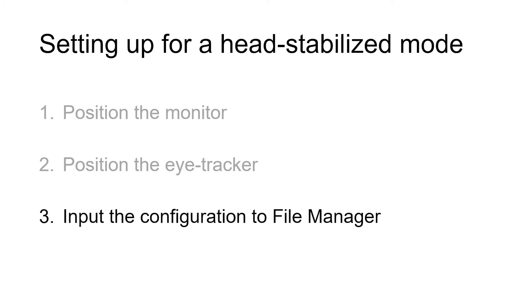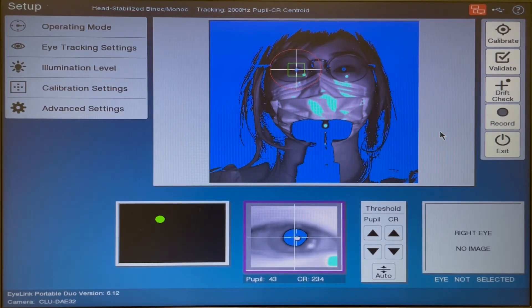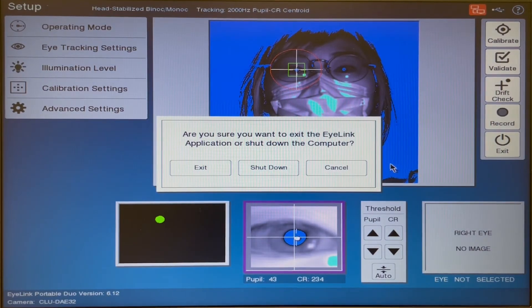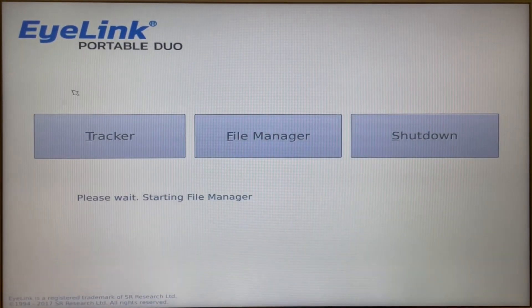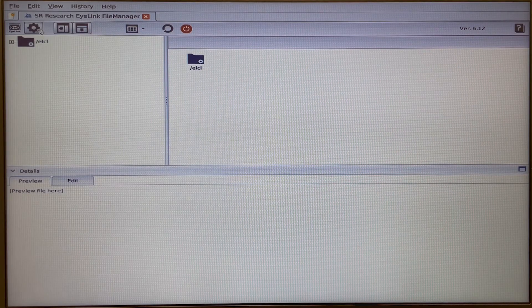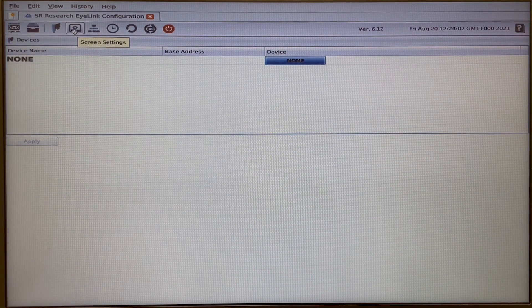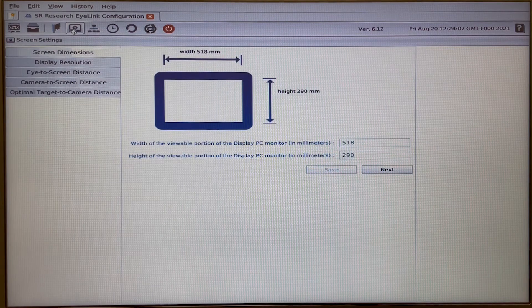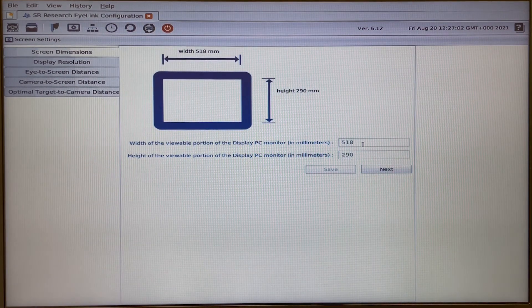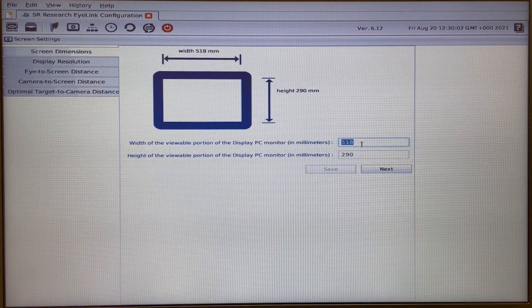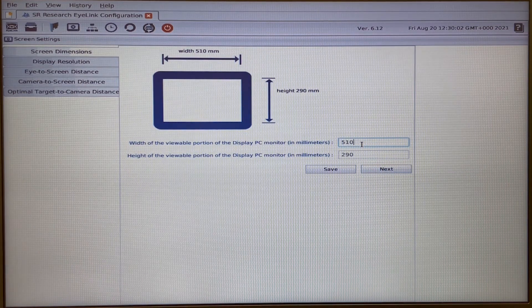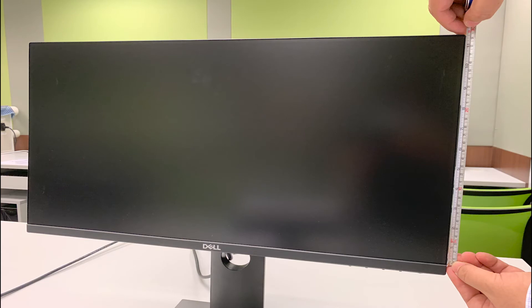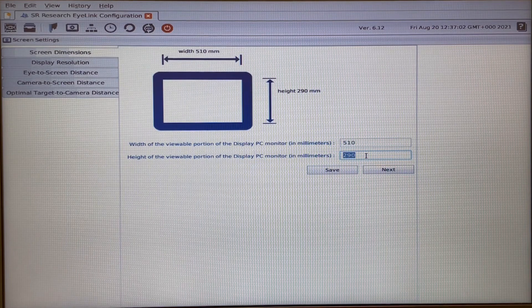Third, input the configuration to the file manager. On the setup screen, click on Exit. Go to File Manager, click on Configuration, and go to Screen Settings. For Screen Dimensions, we need to put in the width and height of the screen in millimeters. We have measured the screen width is 51 centimeters, so we put 510 here. The screen height is 29 centimeters, so we put 290 here.